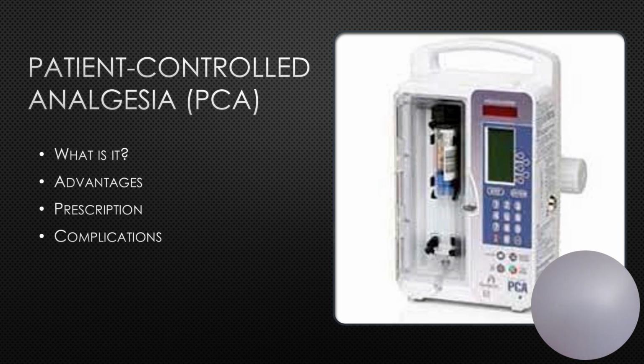The nurse will monitor the respiratory rate, and we count it for 1 full minute, the quality of the respirations, the sedation level, and are there any respiratory noises? And this is done routinely with PCA use, in addition to the amount of drug that has been used and the pain level of the client.